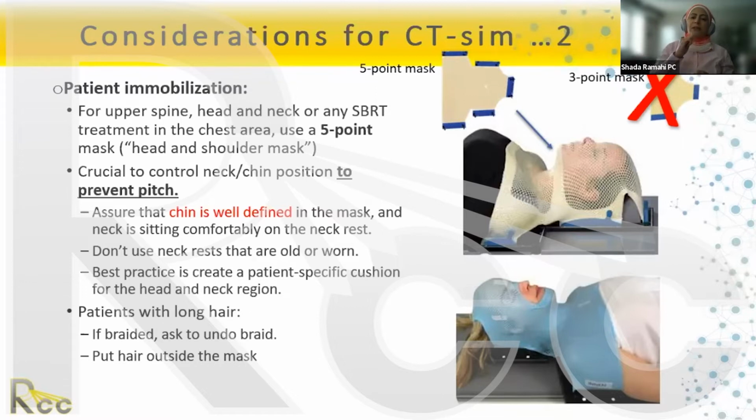We found that they don't give the mask enough time to solidify on the patient. It needs a good 15 to 20 minutes to take the shape. And then some therapists don't give a good definition around the neck and the chin.